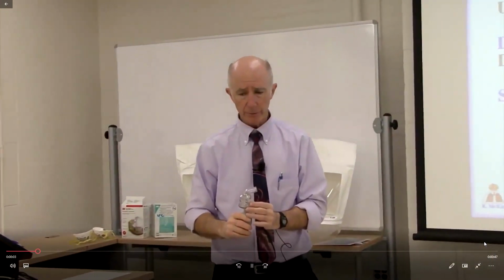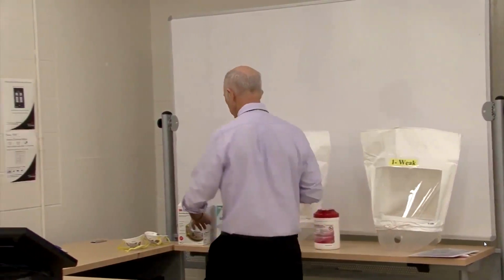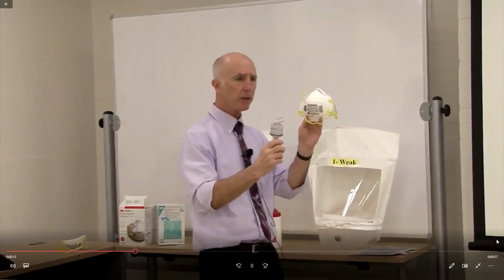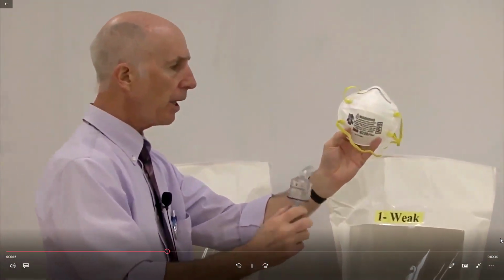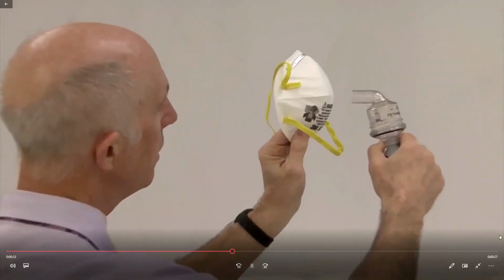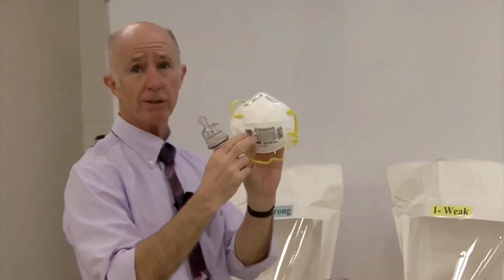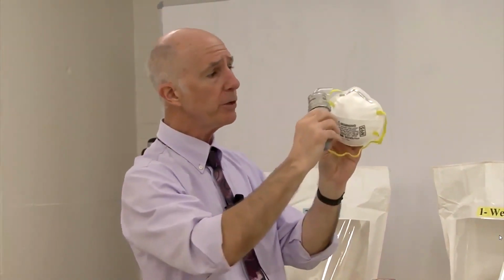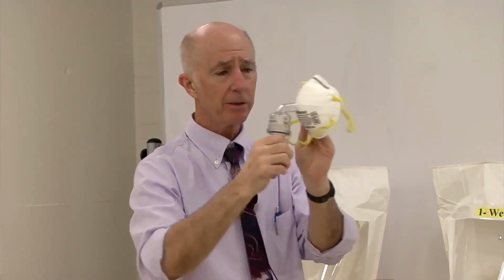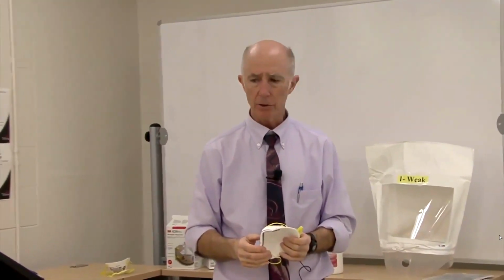The other thing you don't want to do is spray the aerosol directly towards the respirator filter. So imagine a worker was wearing this respirator and they have the enclosure on. If I take the challenge agent here and have it very close to the filter, then I'm spraying that aerosol right up against the filter. But NIOSH has already tested these filters. We know these work. What we want to do is direct that aerosol around the periphery of the facepiece and not spray it right up against the filter. That would diminish the airborne concentration, and when you diminish the airborne concentration, then you don't get an adequate challenge.